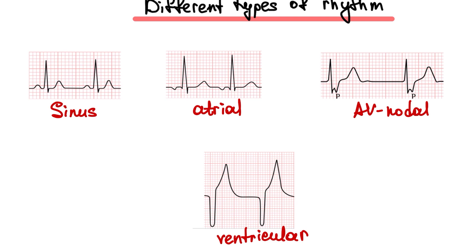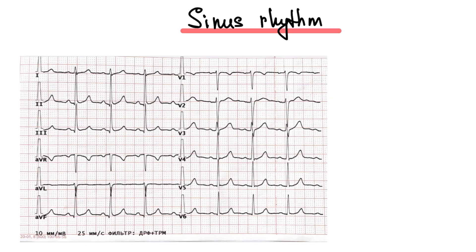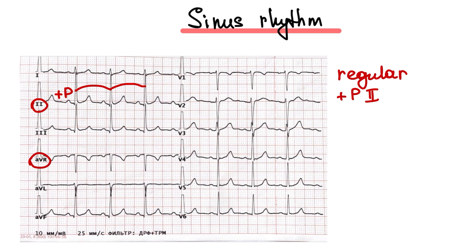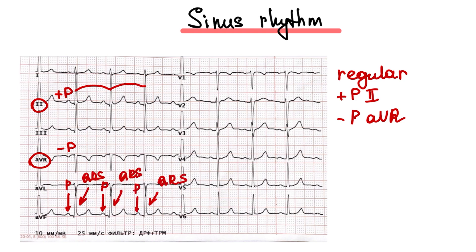And what about sinus rhythm? Sinus rhythm is usually regular. We can see a positive P wave at lead 2 and a negative P wave at lead AVR. We can see a P wave before every QRS complex, with P waves similar throughout one lead. The QRS complex is narrow, and we can see the relationship between P waves and QRS complexes.